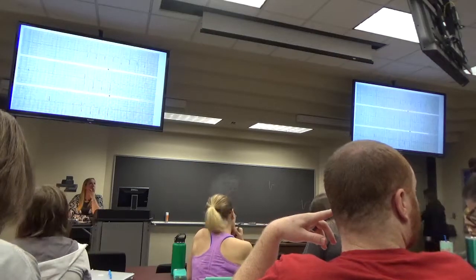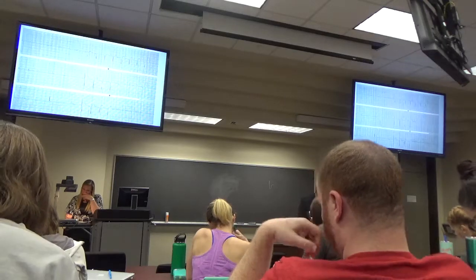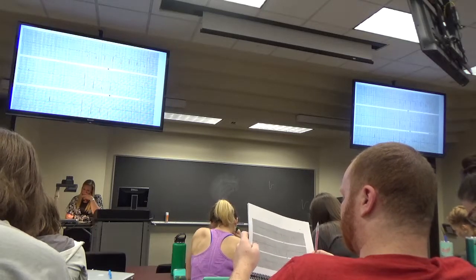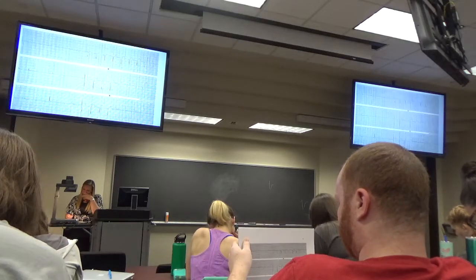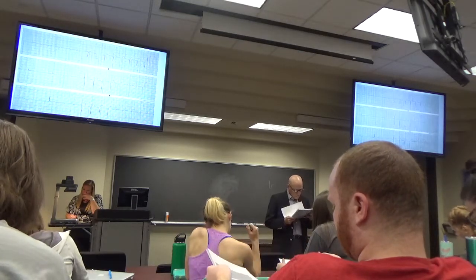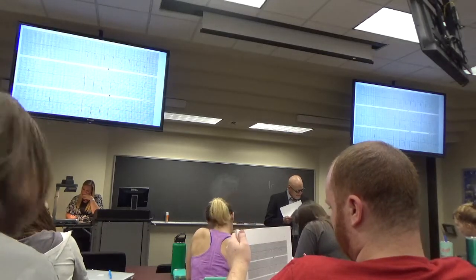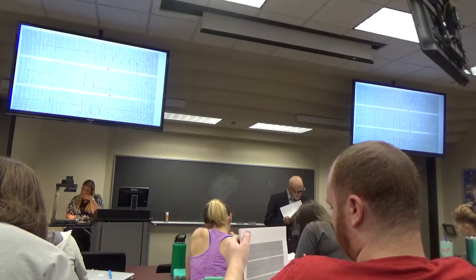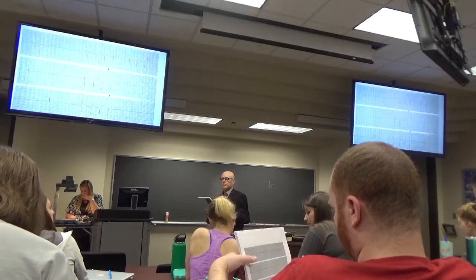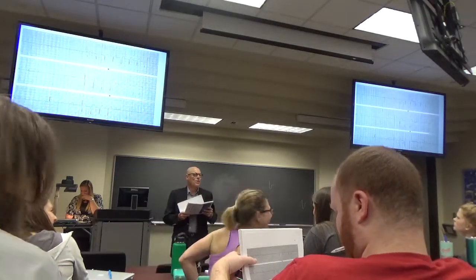I got sinus rhythm, heart rate of 100, PR of 0.04, QRS of 0.12, QT of 0.28, normal axis. I had pre-excitation, an old anterior septal infarct, and left atrial enlargement. What was the PR interval? I had 0.04. I didn't know which lead I measured it in. Look back at it again in the limb leads and see what your PR interval is. It's not short.